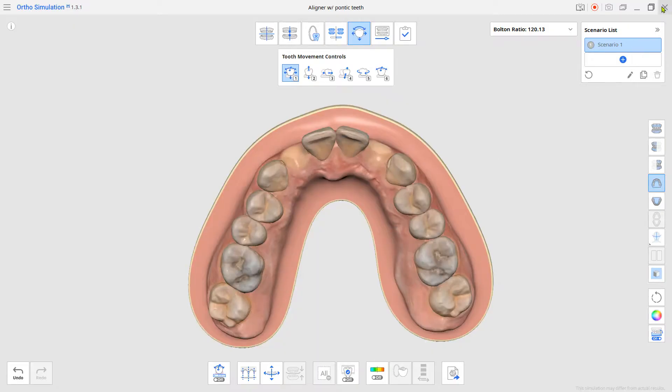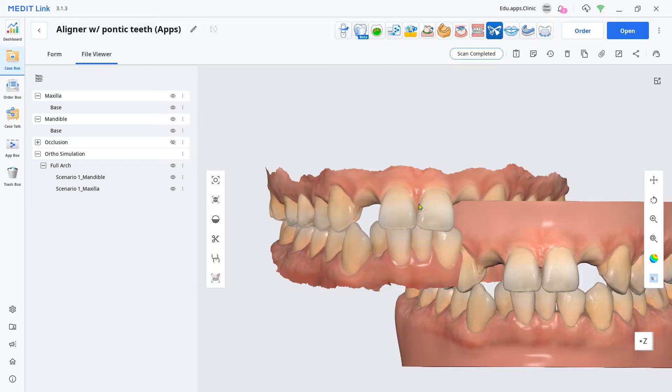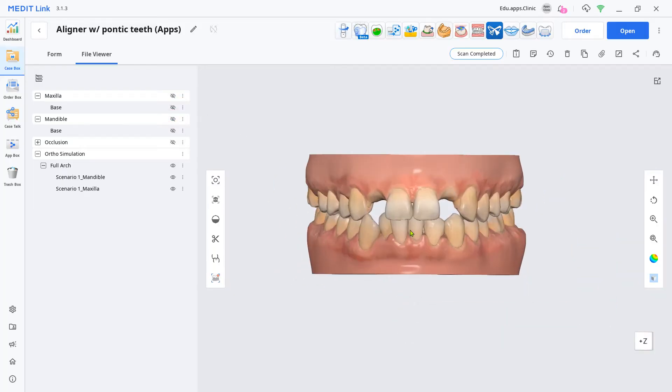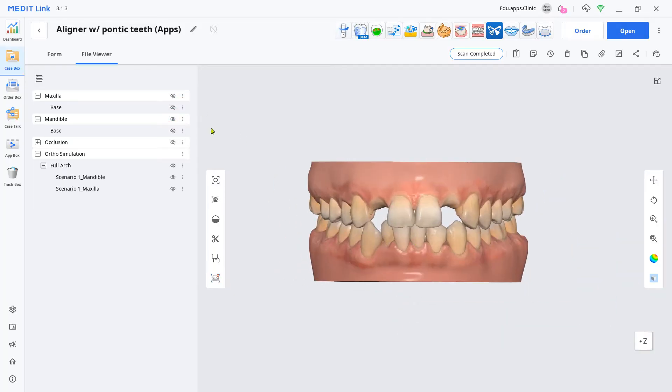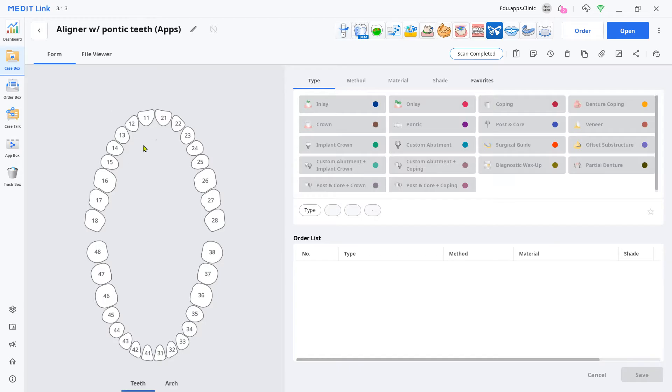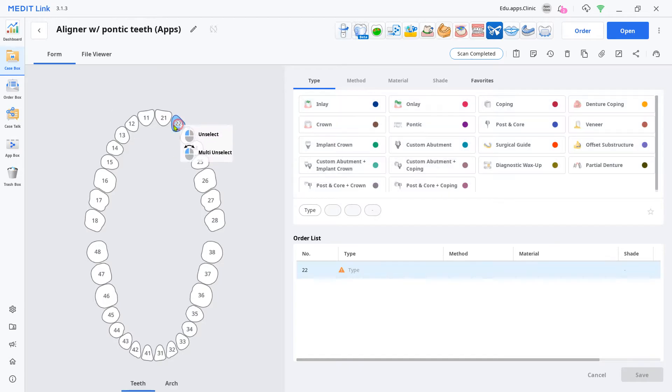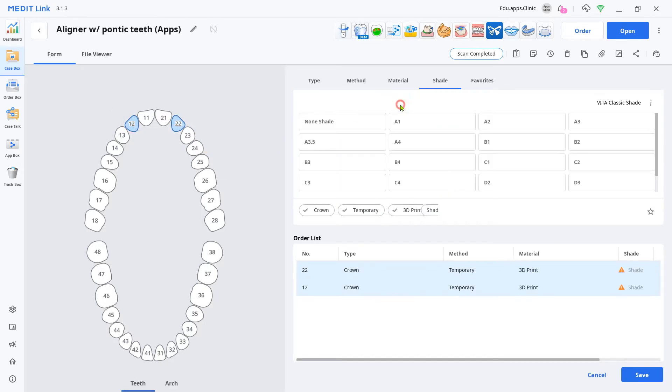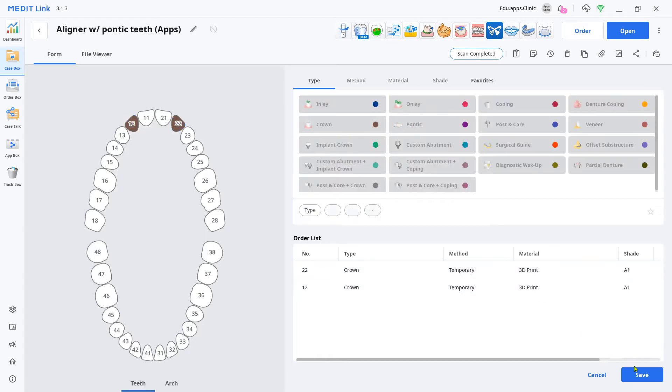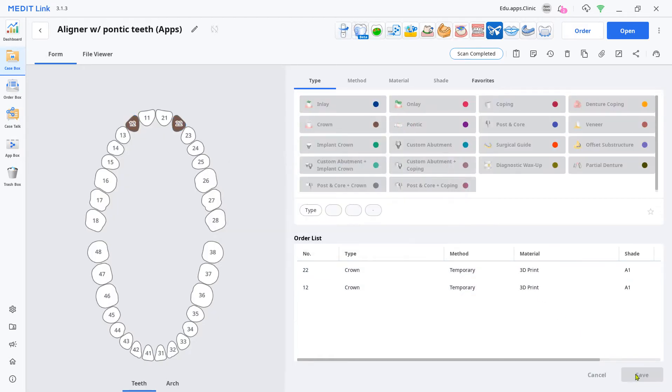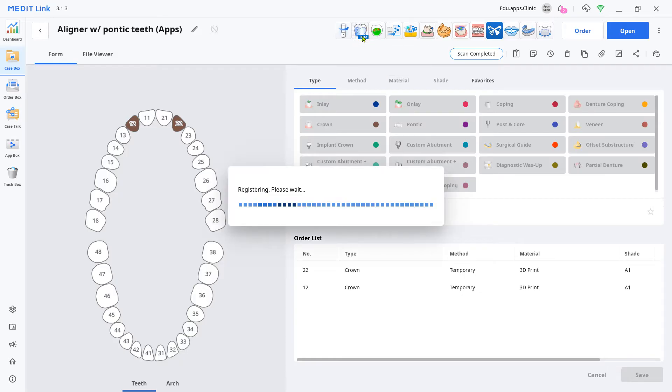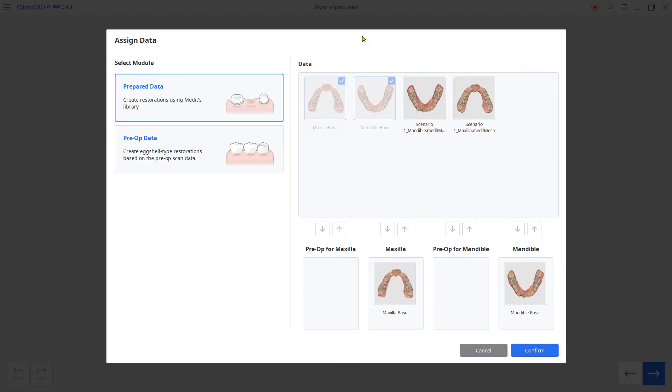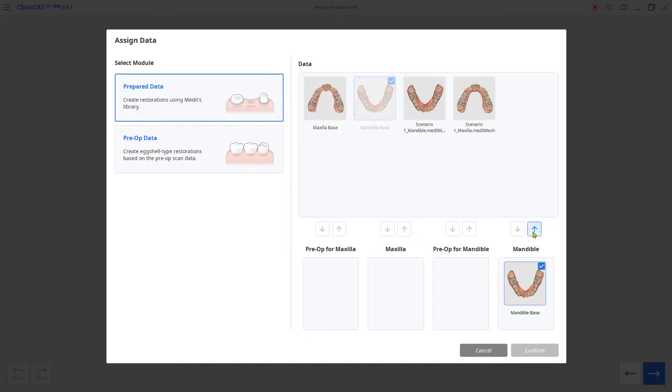Now we are going to create pontic teeth with this adjusted data. Go to the form tab, set the missing teeth as a crown and a temporary. Load the ClinicCAD app.